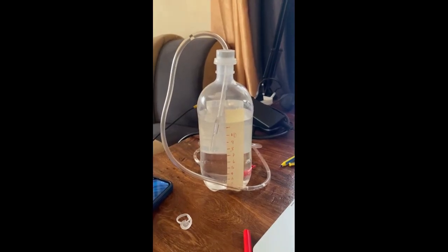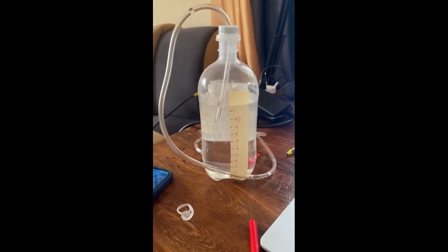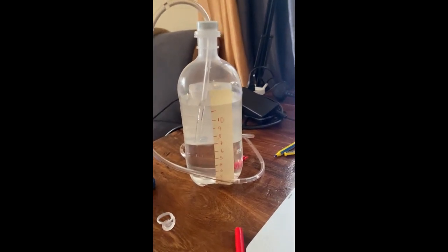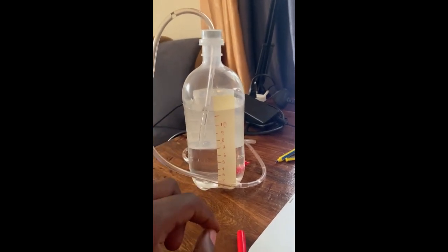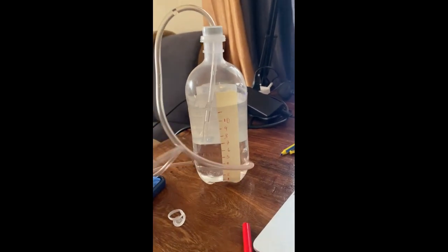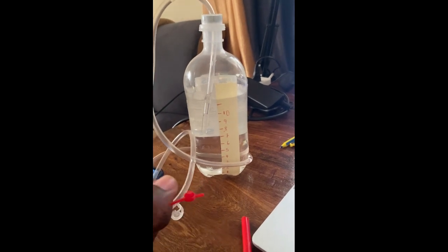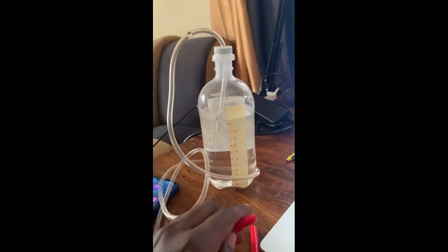Okay, so I've placed the NGT, and just like that, we have the source of our pressure on the expiratory limb. As you can see, it's at around 7 centimeters, so it's 7 centimeters of water. The pressure generated will be dependent on how deep you go. From there, on this end, we are just going to connect with the nasal prongs tomorrow, and the circuit, the prongs to the baby. It will be pretty simple. We're almost done.